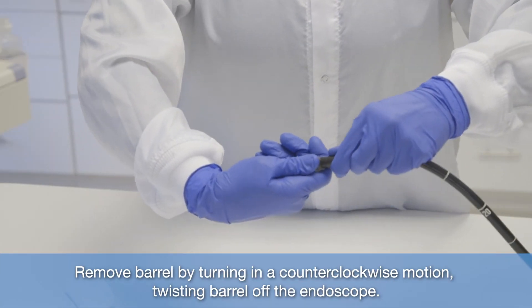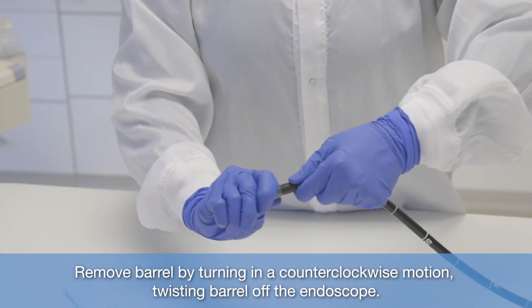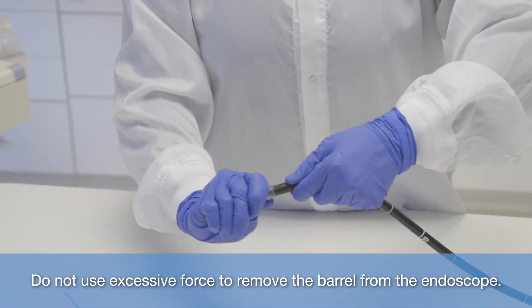Remove barrel by turning in a counterclockwise motion, twisting barrel off the endoscope. Do not use excessive force to remove the barrel from the endoscope.